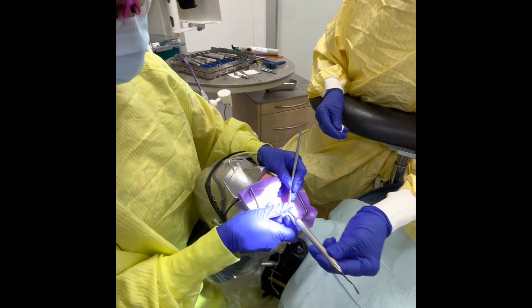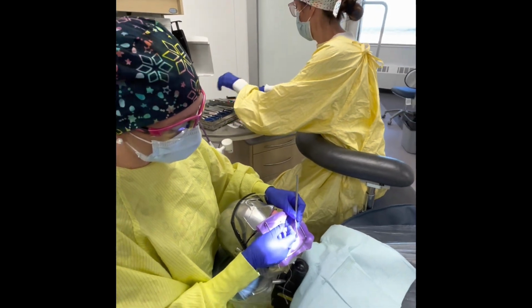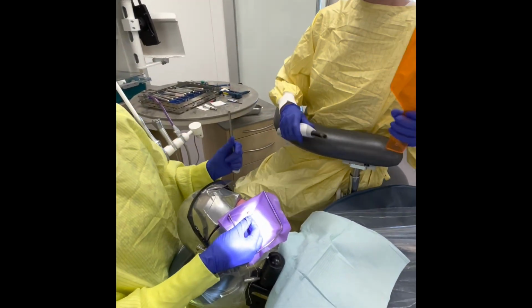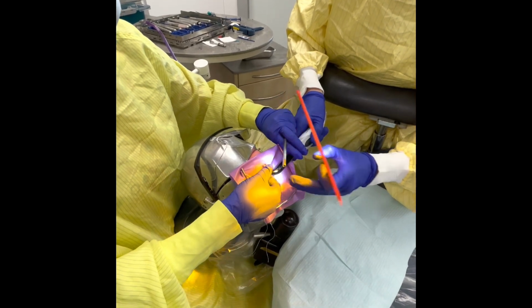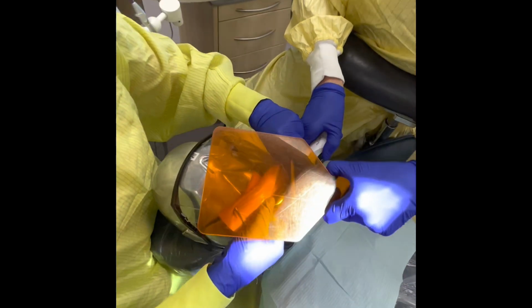Okay, thank you, Stacy. You are welcome. So we are ready to cure the composite. So the operator will hold the mylar strip and help guide you into your filling here. And this again is 20 seconds.